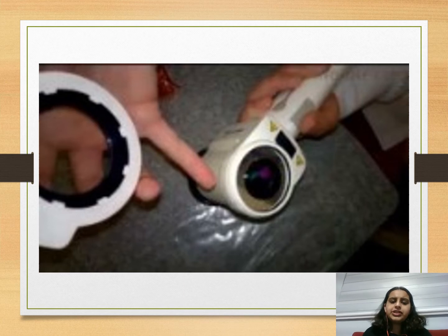Make sure you protect your eyes from the blue light, obviously, as well. Looking through there, like she's saying, you might see some black lesions, and those are the parts that we want to notice. Note this down: where is it? The area? Is it on the dorsal of the tongue? Is it on the left buccal mucosa adjacent to the 2-7 or 3-7?